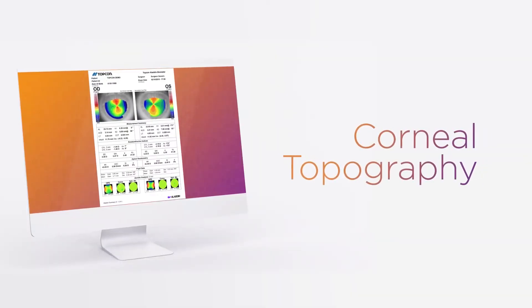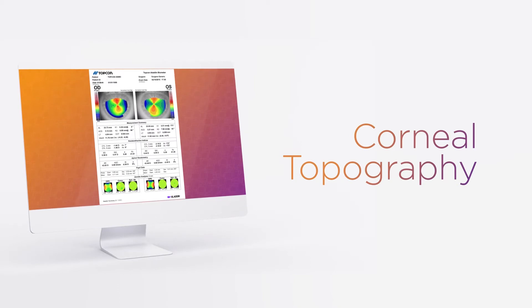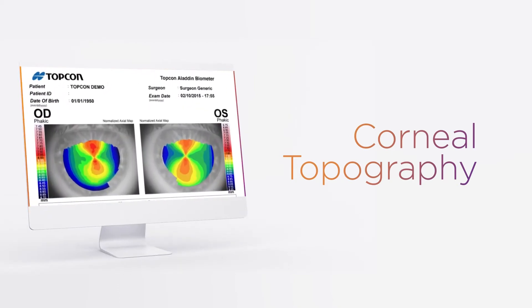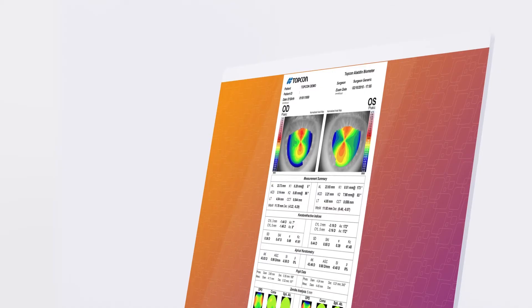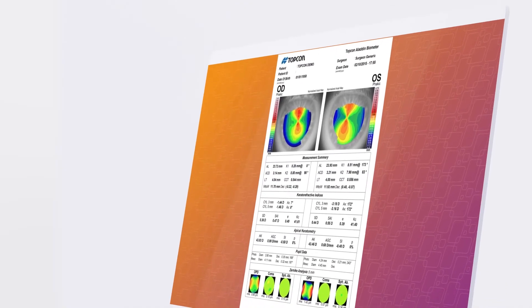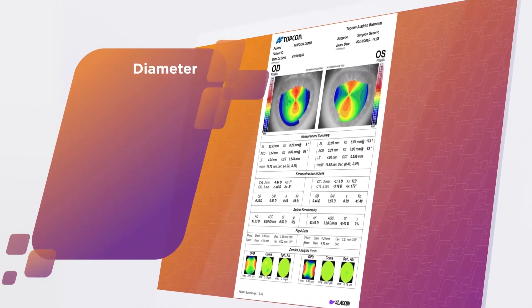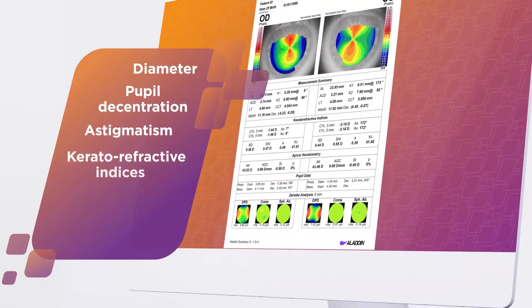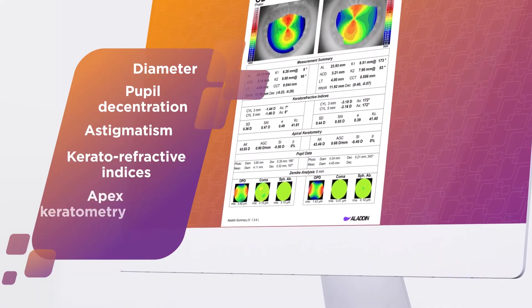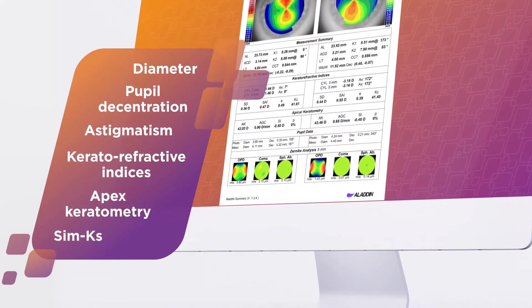A comprehensive topographic report shows the corneal map in the selected mode, either absolute or normalized, and axial or tangential, alongside the corresponding corneal data, such as diameter, pupil decentration, astigmatism in three different zones, keratorefractive indices, apex keratometry, and SimK.